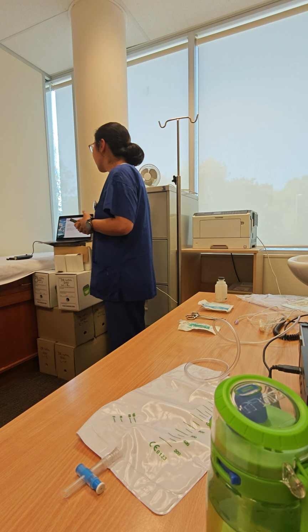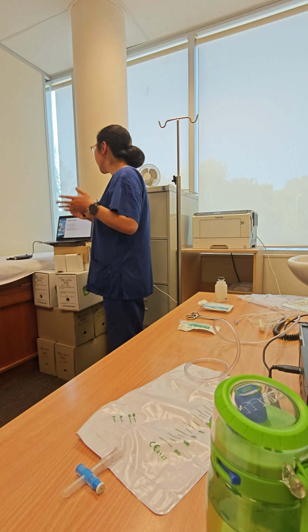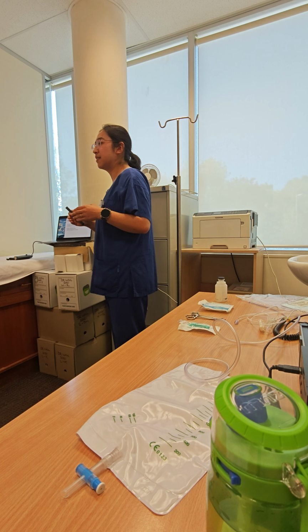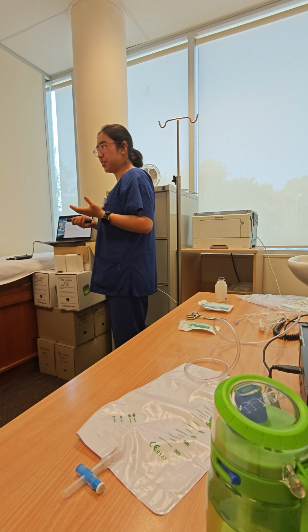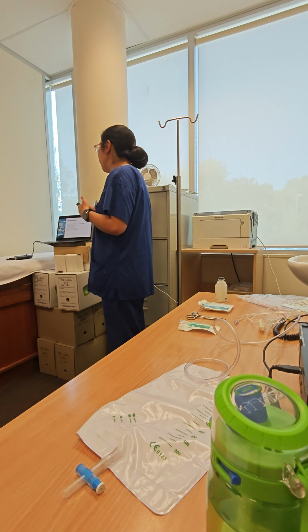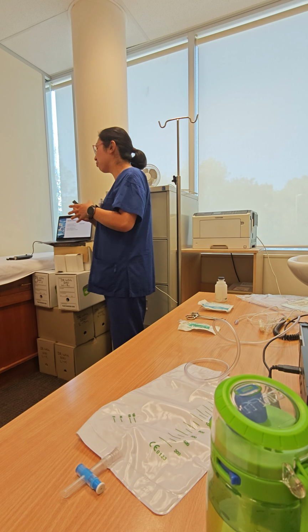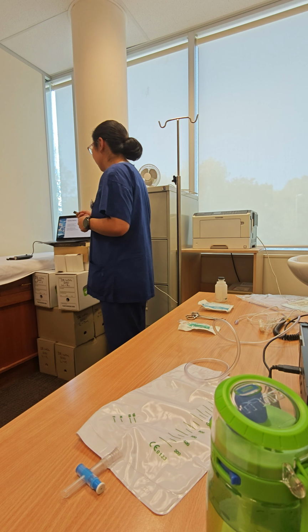In my case, I have a 65-year-old male patient who just underwent a radical prostatectomy, which means his prostate was removed during the procedure. That's the reason he came into our clinic for the first cystogram on 25th January, to check if there is any leak in his bladder.